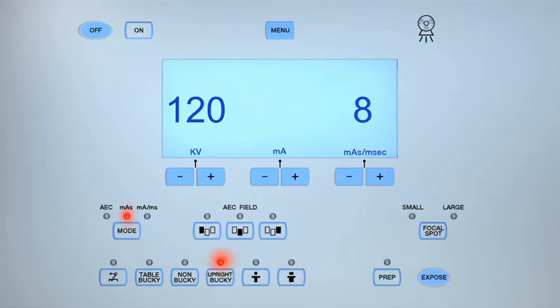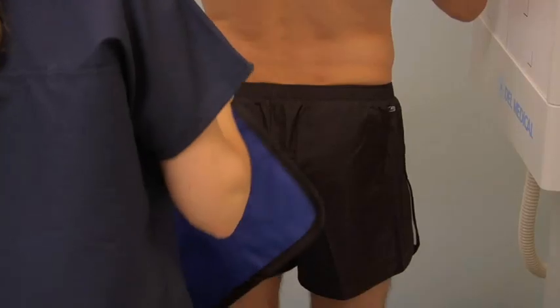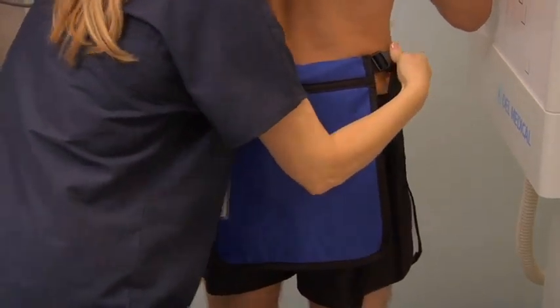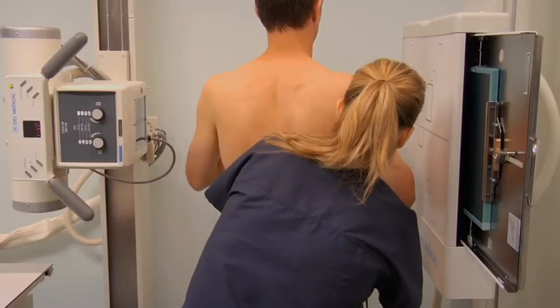Select the upright bucky setting and the small focal spot on the control panel. Set the exposure parameters to between 60 and 70 kV and 40 and 50 mAs. Place a protective lead shield over the patient's reproductive organs.